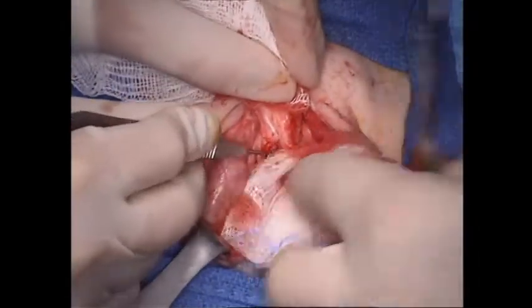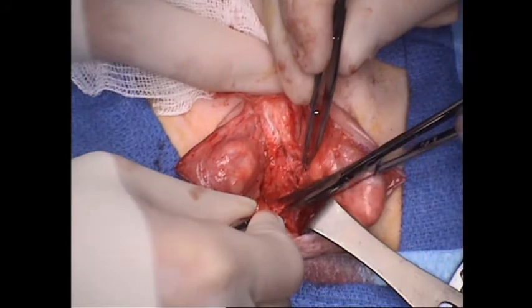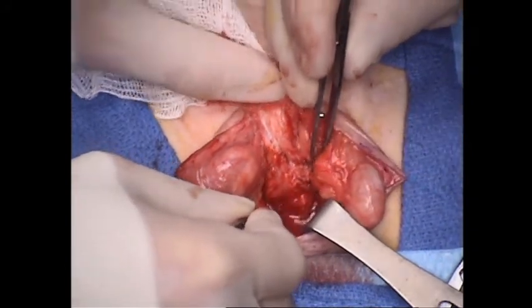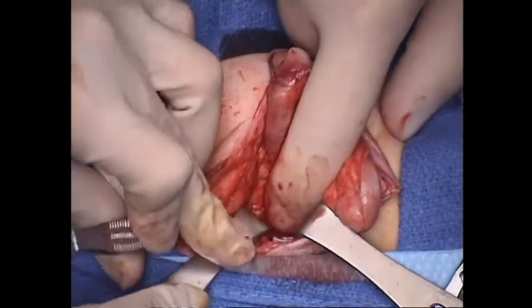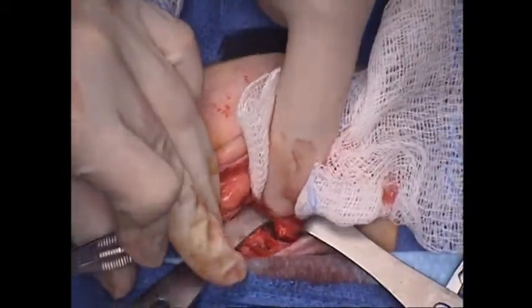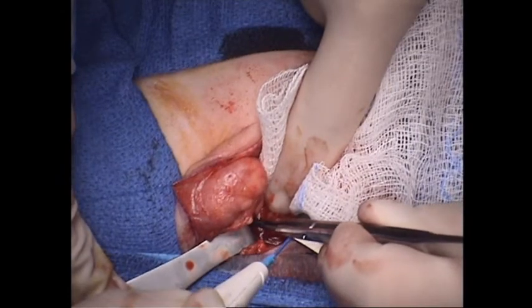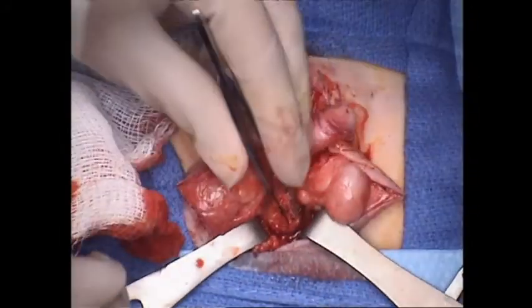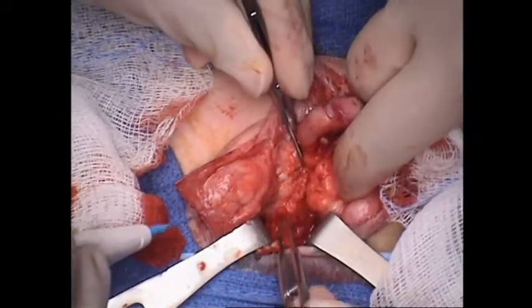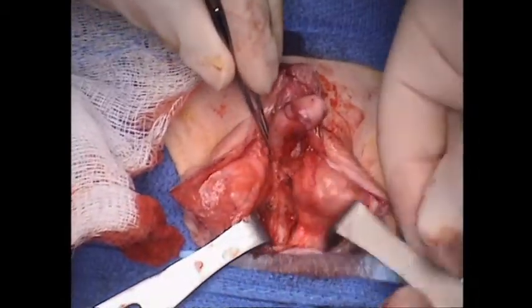So we're just continuing to release. A little bleeder over there, unfortunately. We'll ignore it for a second and get a bigger one. Okay, so we'll stop that. Okay, I can't see. Need me to move a little bit? Got it? Okay. There's still a little one right here. Let's go ahead and get that while we've got the Gerald's. Okay, let's reset here for a minute.